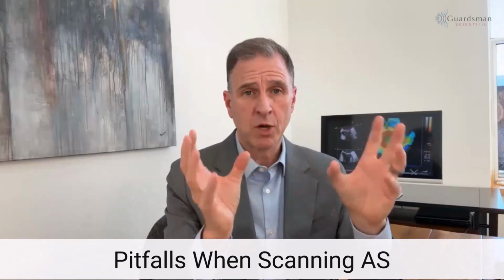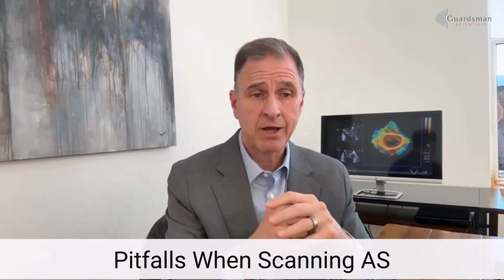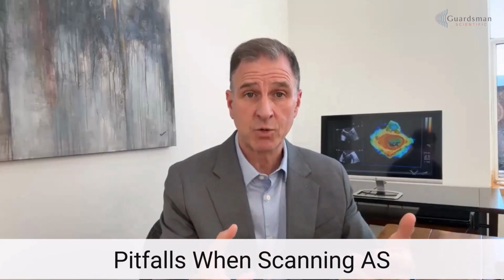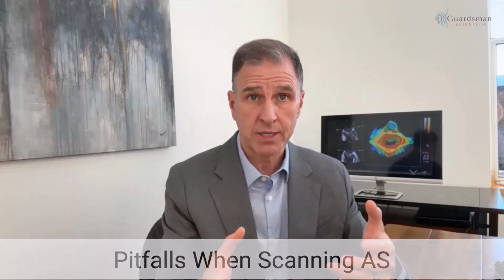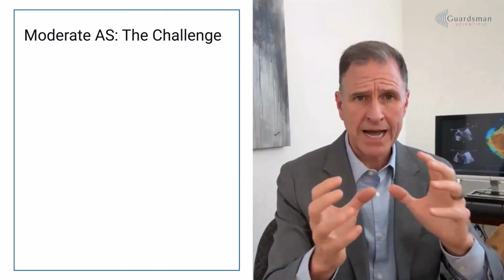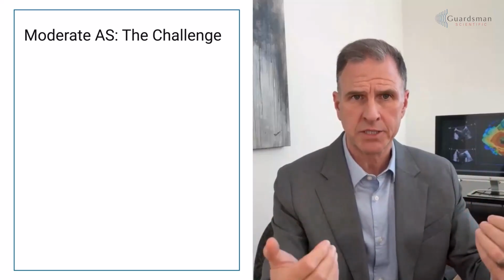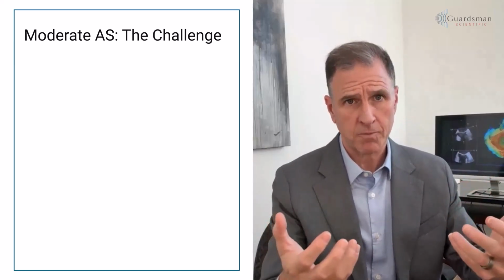Now, you have those elements set, and of course, there are several pitfalls that you might encounter as you're scanning to prevent you from acquiring the data appropriately. Now, if the patient has mild aortic stenosis or very severe aortic stenosis, those cases are more straightforward because the data is obvious and will always be consistent throughout the study. The more difficult patients are the ones in the middle, the moderate range, the ones that are often referred to as low flow, low gradient aortic stenosis, or the really low flow.